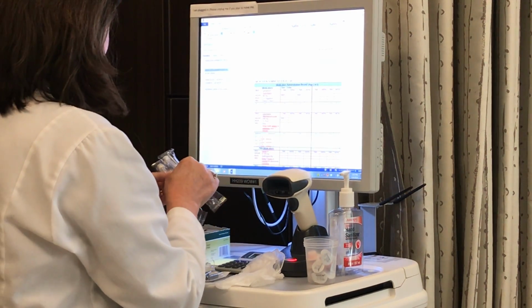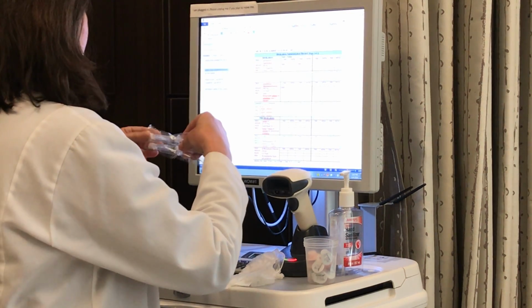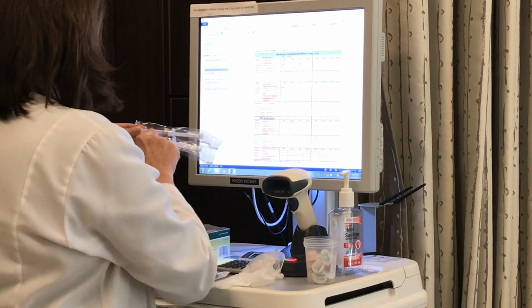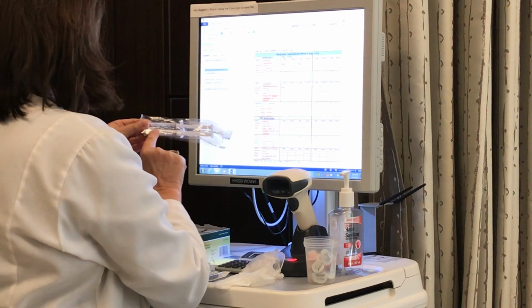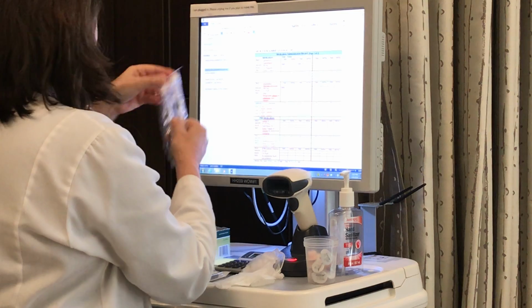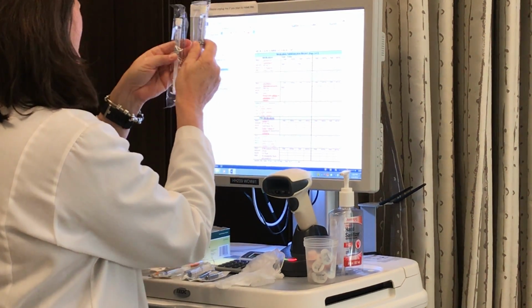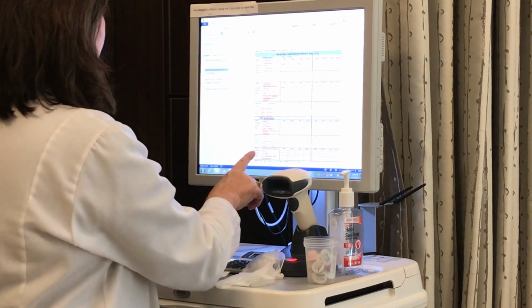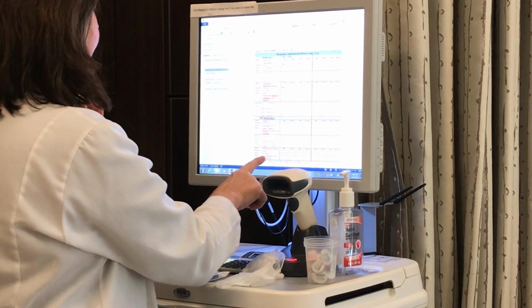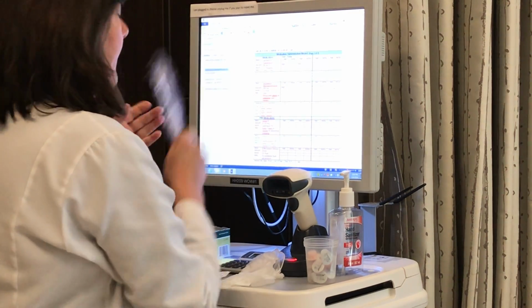My first check for my saline flushes, which are located in the PRN section of my MAR. For Diane Curtin, I have drug ordered 0.9 sodium chloride, and I have 0.9 sodium chloride and 0.9 sodium chloride. The amount is 2.5 mLs, and in my syringes I have a little more than 2.5 mLs with an air bubble, so I'll be doing an adjustment there. The route is IV push. I'll be administering these IV push. Frequency is as needed per flush protocol, and the time ordered is now, so I'll be giving it now.